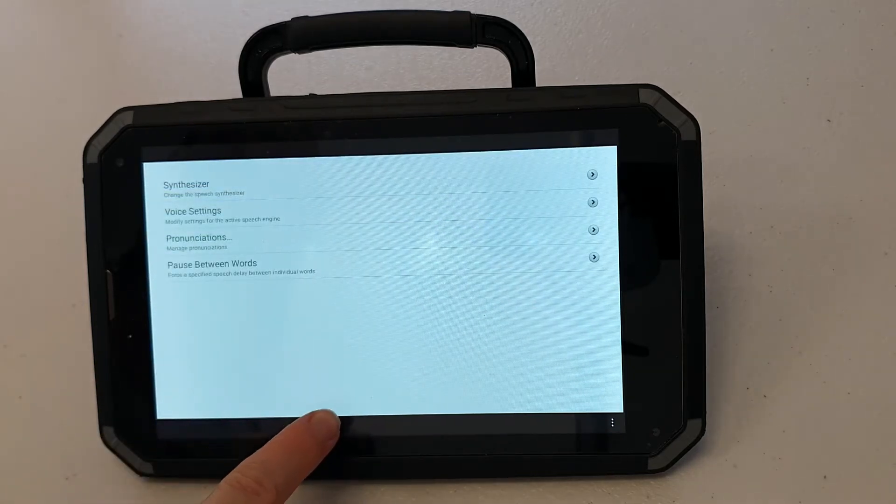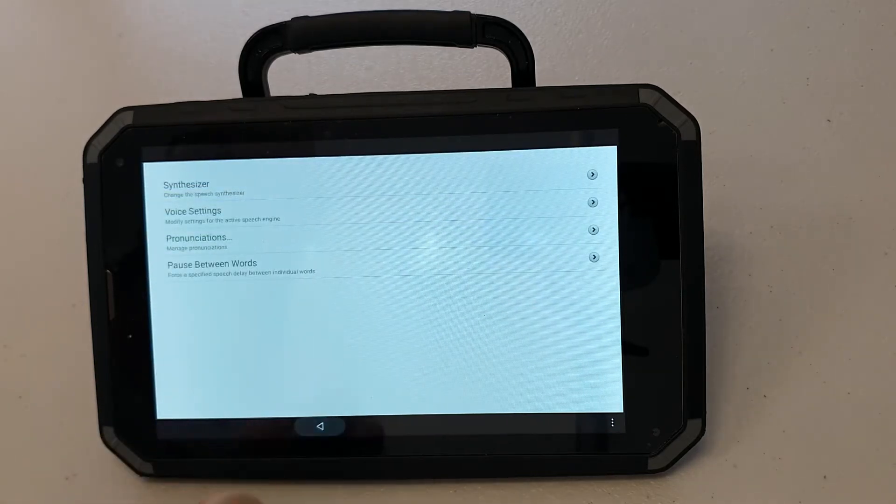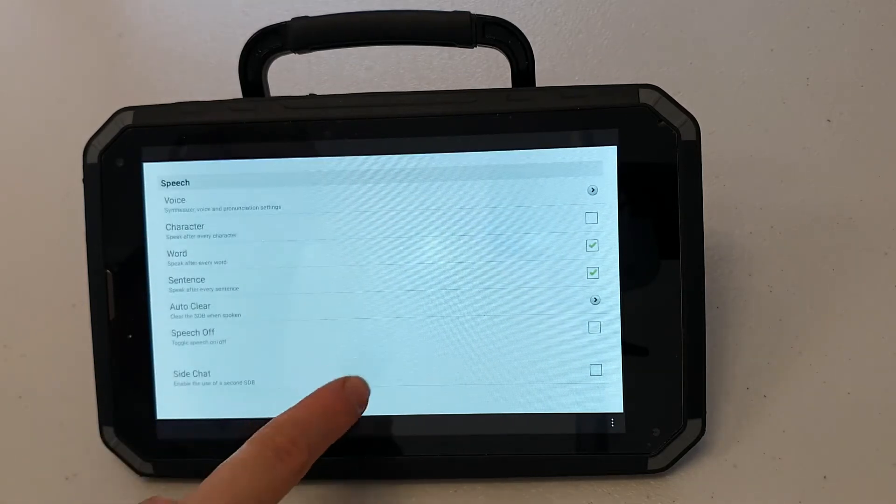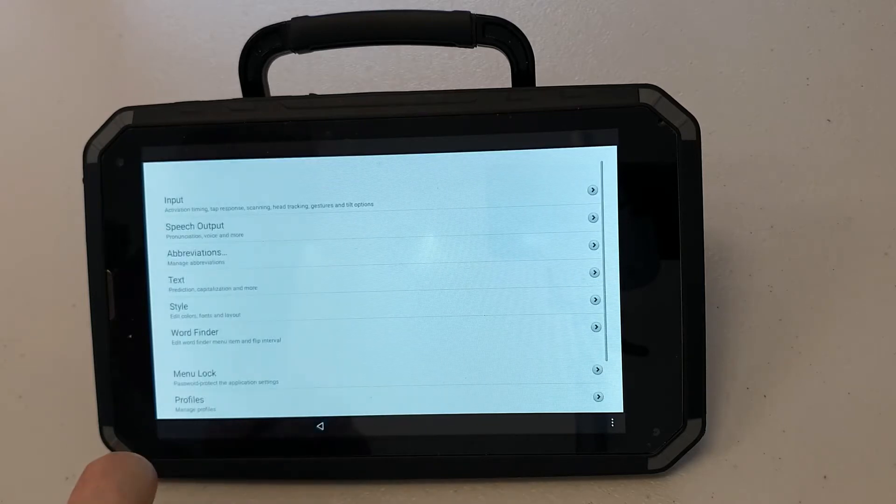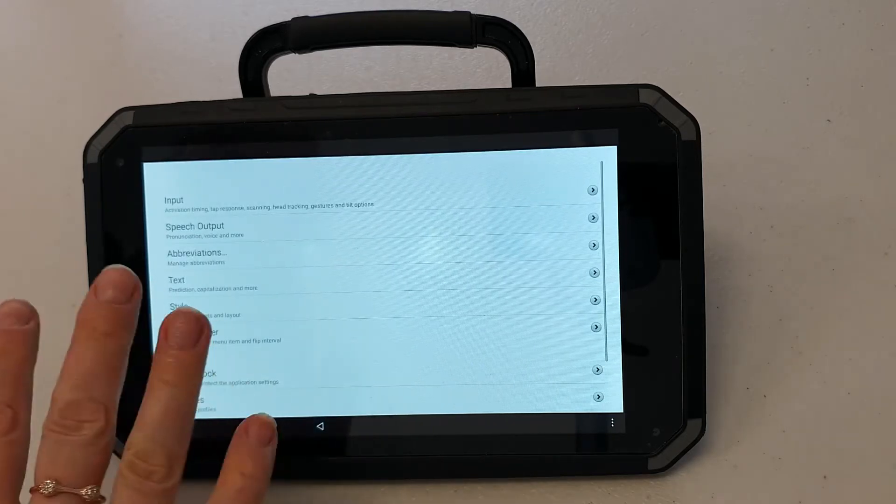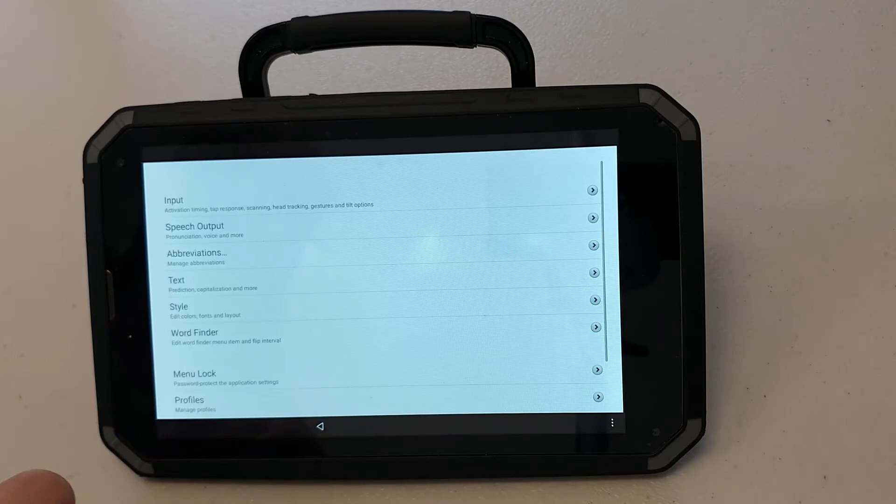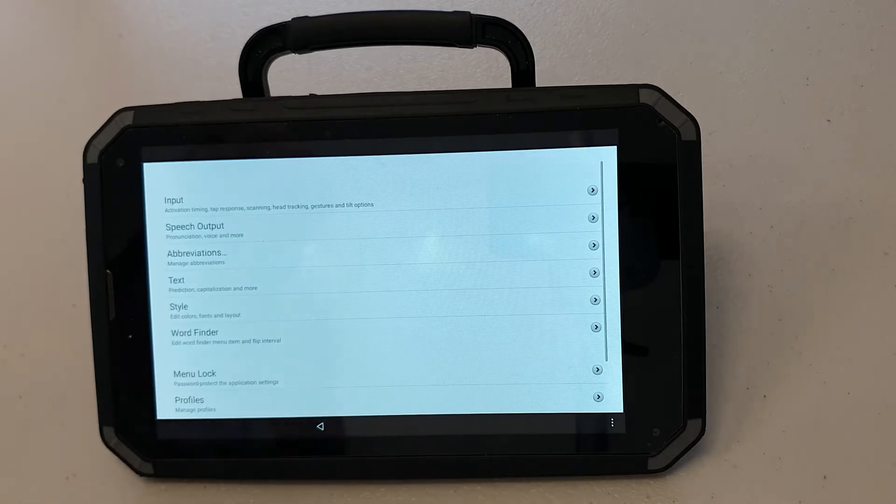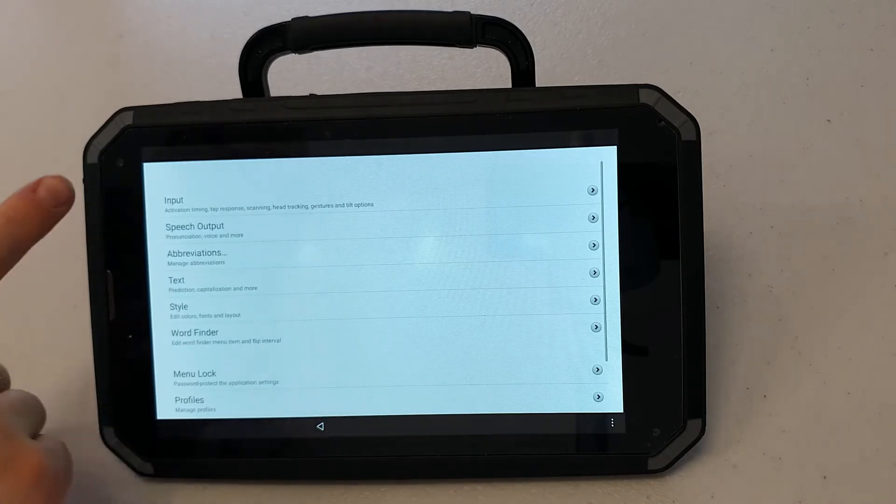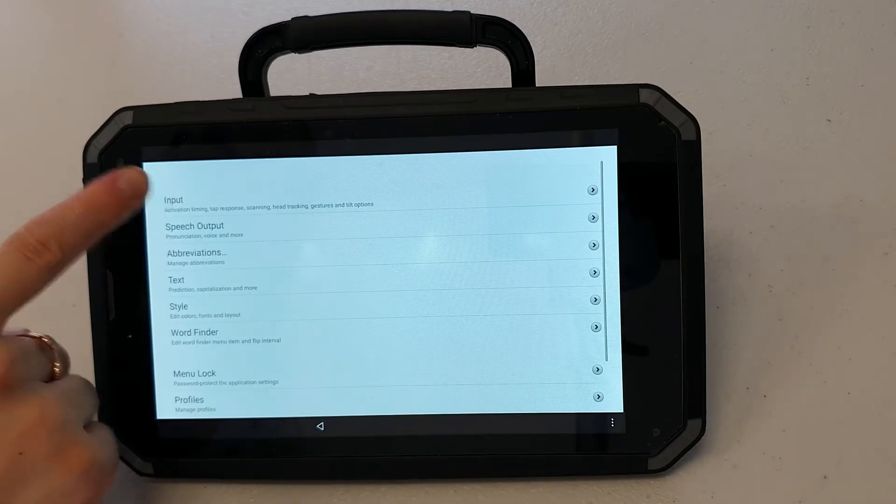I'm going to go back, go back. I'm back in my main menu now. The next thing I can do is change some of the visual effects on this device. To do that I'm going to press input.